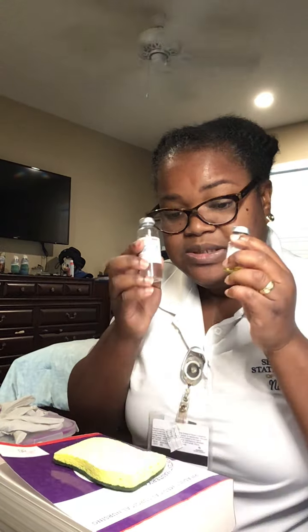Okay, now I already washed my hands. Now I checked the allergy for my patient. I'm going to retrieve my medication from the medical cart. When I retrieve my medications, I see that I have two vials. Okay, I have to do my first check on these two. My first check is the right patient. This is Anna Pawlowski.